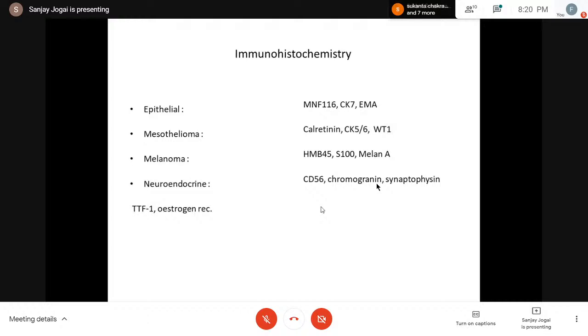I thought, what is happening here? And thankfully, it's always a good idea to know people whom you can send your cases to when you're starting as a consultant. Always good to have some hand-holding for difficult cases. If you're making some rare diagnosis, it's always a good idea to have it supported rather than making a rare diagnosis which may not be correct. So in this particular case, it clearly shows on this slide that I haven't included any endothelial markers, and that is what I had missed. So I had done everything and I thought I can't make a diagnosis. It has to be something, but what do I do?